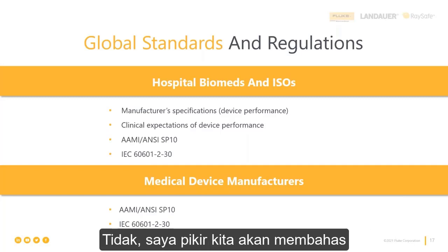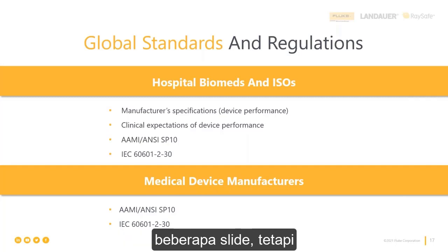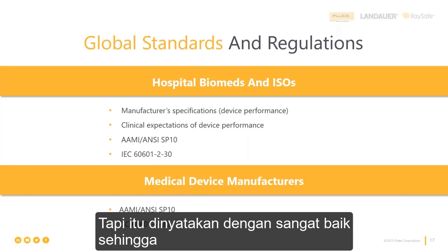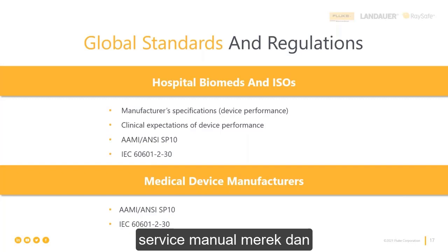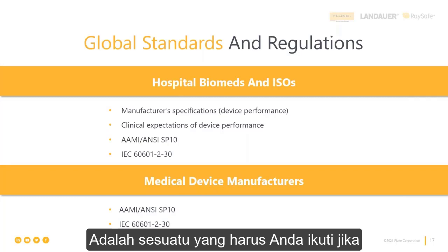No, I mean, we're going to cover a little bit more depth there in a couple of slides, but that's very well stated. So really, there are no shortcuts. The manufacturer's test procedure from the brand and model specific service manual is the one you should be following.